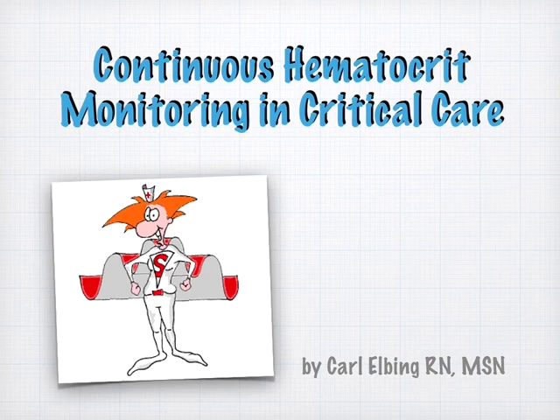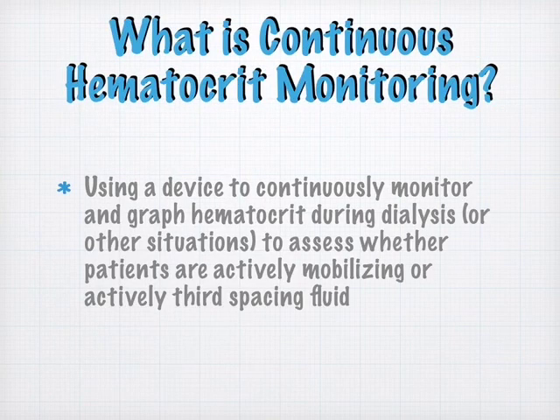The hematocrit monitoring really threw me for a loop because I found that I really didn't understand fluid shifting in patients until I had my experience with this device. So I wanted to share what it is that I've learned about it. So, what is continuous hematocrit monitoring?